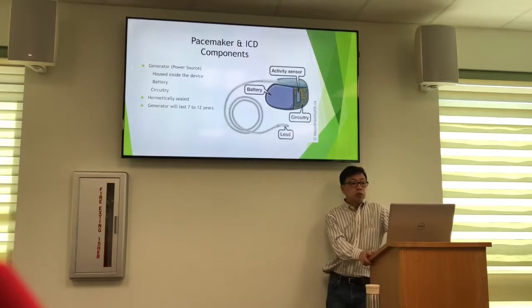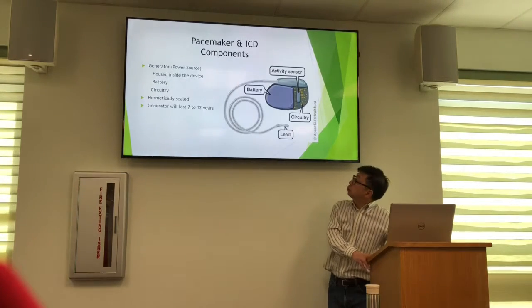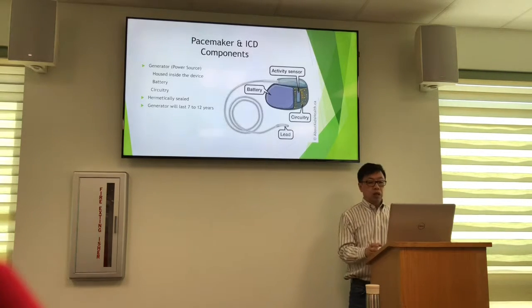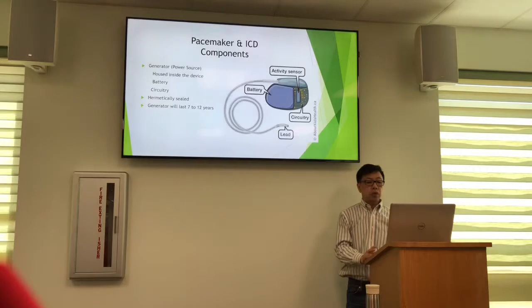And this is a simple abbreviated view of how a pacemaker looks. It contains a logic board, the sensors, and batteries. The battery takes up more than 60% of the bulk of a pacemaker because it has to last a long time. We definitely do not want to replace it every couple of years.